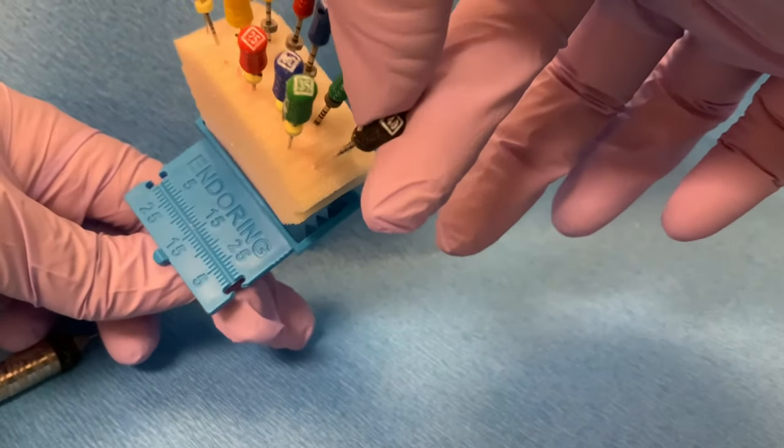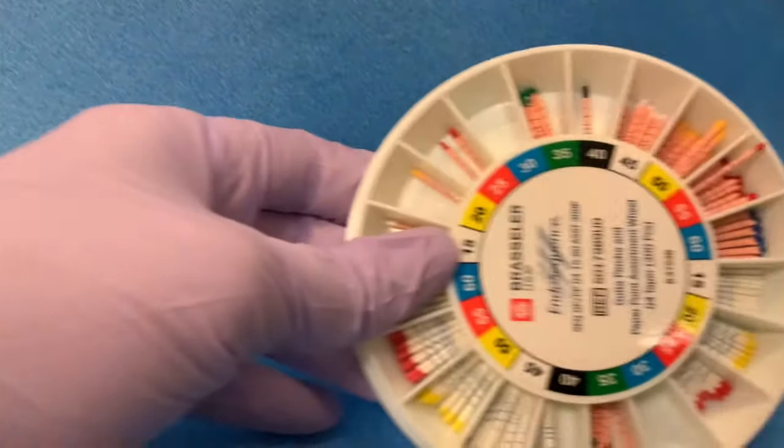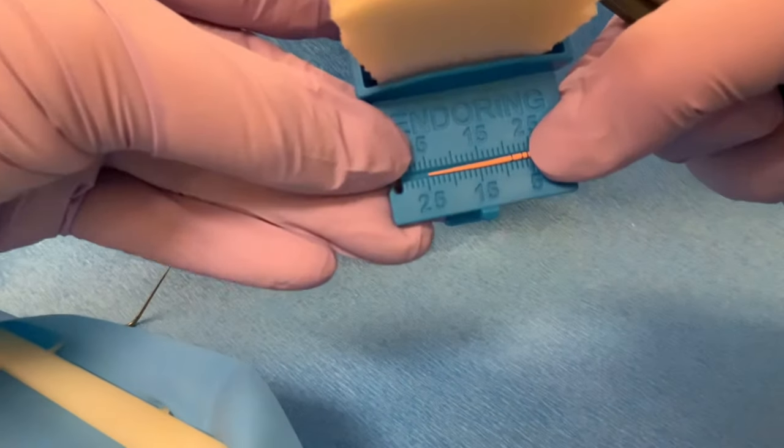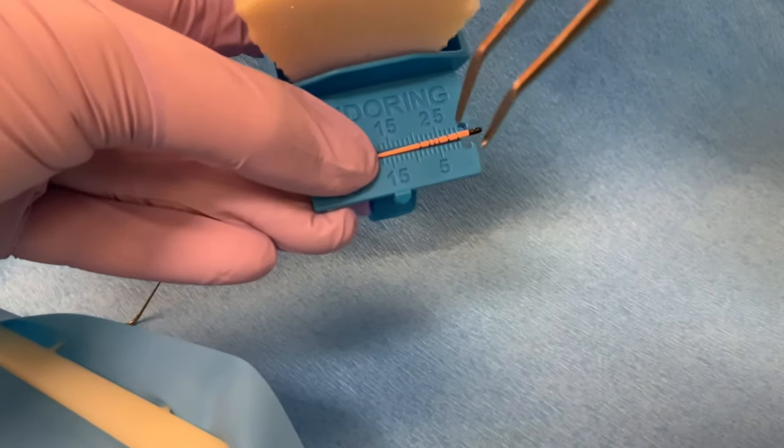To begin, select a master cone similar in size to the master apical file, which was a size 40 for this tooth. Measure the master cone at the working length, which was 25 mm.